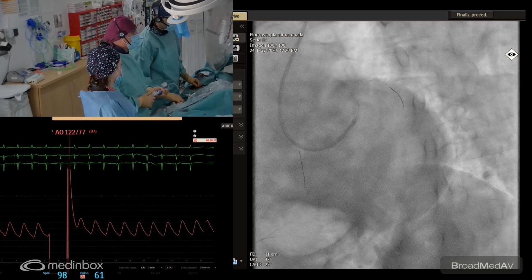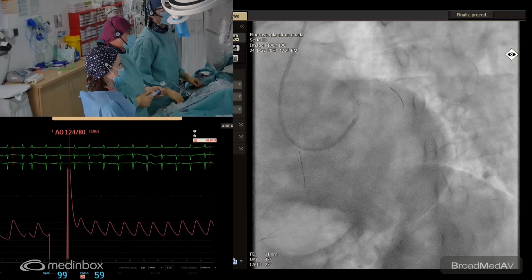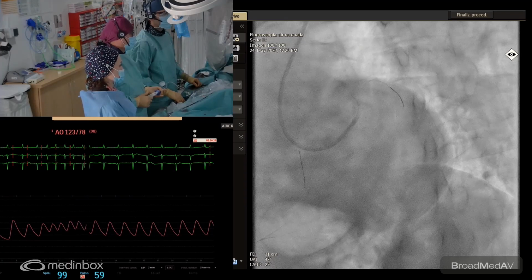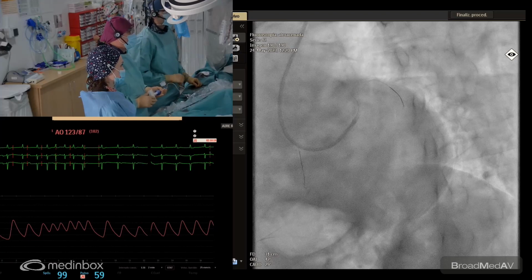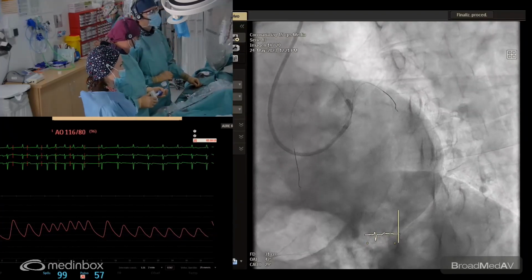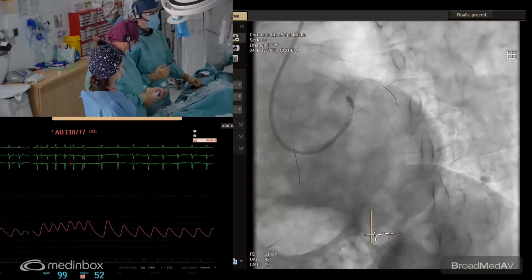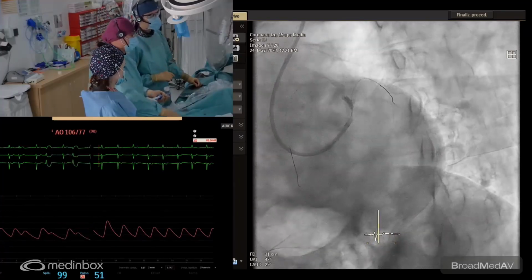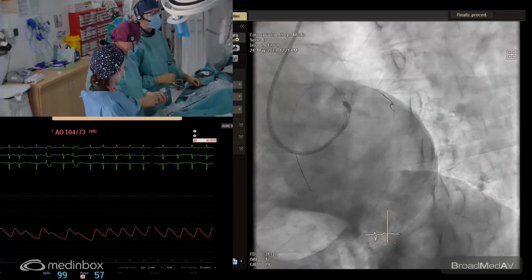Now I'll tell you. 4 atmospheres is the same sequence all the time. 4, and I press the button again, and the pulses have been administered. You can see the ECG. Some of them are captured, some are not. The pressure is okay. Okay, 6 atmospheres. 6. Expansion is quite good here. Down. I think we can do another cycle here.